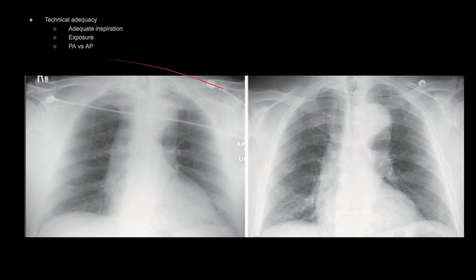PA versus AP: if I were to give you both of these, you should be able to tell me which one's PA and which is AP. It's a little bit of cheating because this one's labeled. But what's the difference between the radiograph on the left and the radiograph on the right? If you were to say that this heart kind of looks fuzzy and slightly bigger — that's the AP radiograph. The heart is magnified because it is further away from the detecting plate.